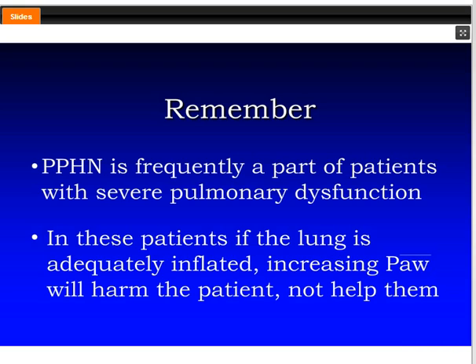But when I set up, I start them on a mean that I think would be adequate. So if I'm intubating a brand new small preterm infant, we'll say a 25 weeker who weighs 800 grams, I would start with a mean airway pressure of 10, and I would adjust upwards as needed to improve oxygenation.